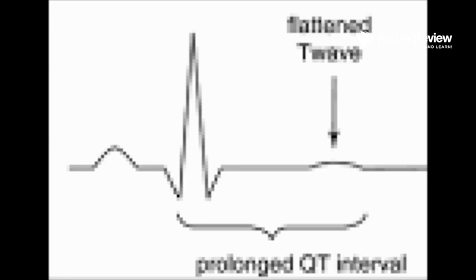It was quite prominent. So, in general, hyper is going to peak up your waves, give you more of an amplitude, and hypo, they're going to be softened, dampened, flattened. So again, this is hypomagnesemia, not enough magnesium. Those are the two basic EKG changes that you will see. The most severe and buzzword for the NCLEX that you could see is torsade de pointes. So let's pull up that EKG and talk about that rhythm change.